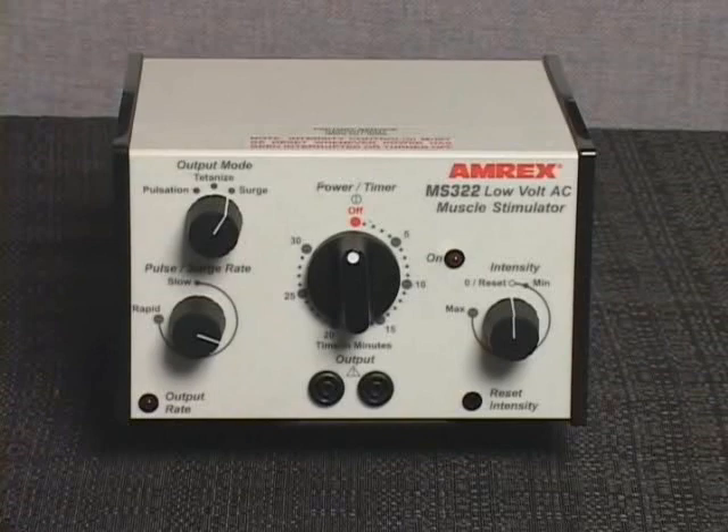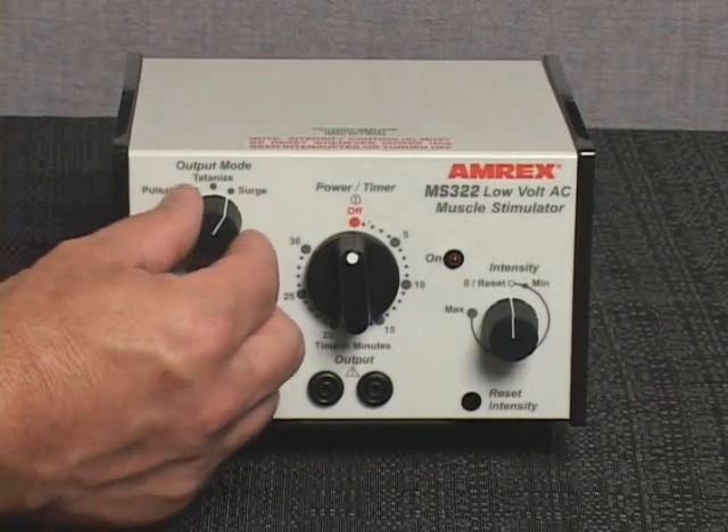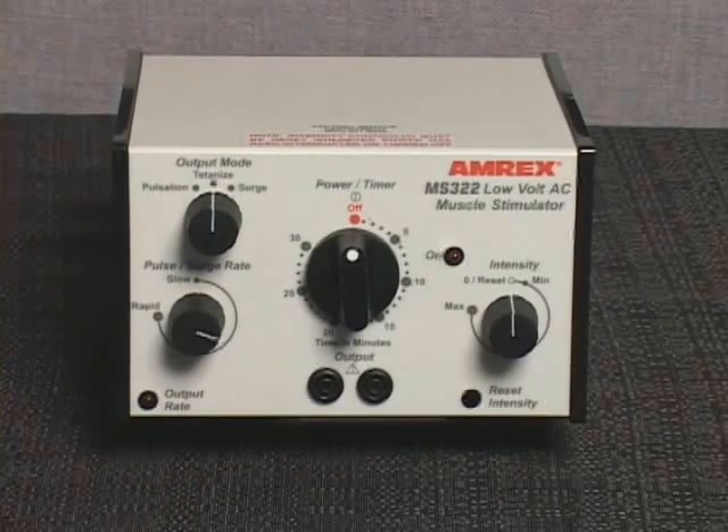Avoid applying one patient's intensity setting to another patient. Set the output mode control to tetanize. The intensity level should always be set while the device is in the tetanize mode. This will prevent unexpected surges of intensity during the initial patient setup in surge or pulsed modes.